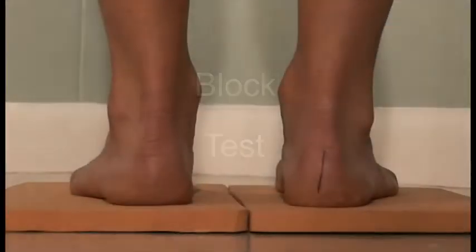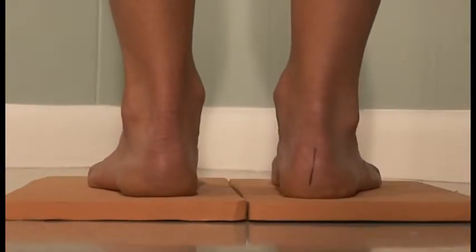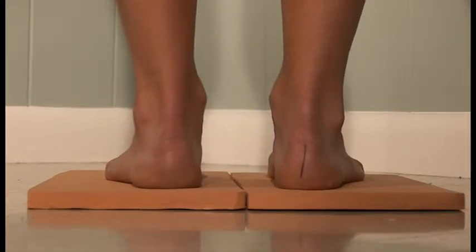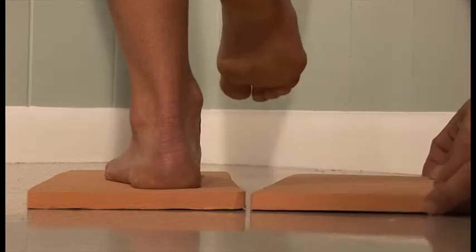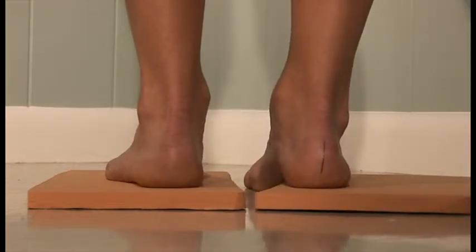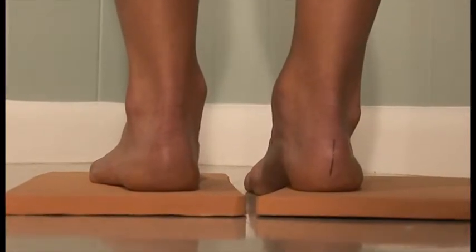Our final test will be to see if the relief of the first ray will result in a better position for the rear foot. We place the patient in a standing position and then put the first ray off the block. As you can see, this improves the rear foot position and indicates that the Hoke orthotic device will assist the patient in assuming a more neutral position during gait.